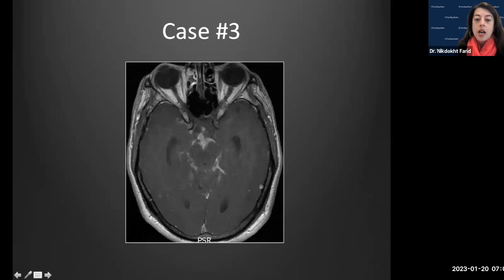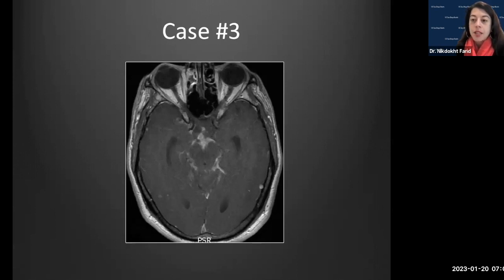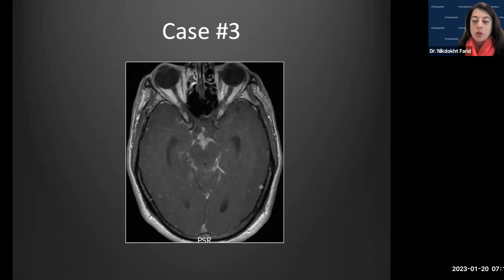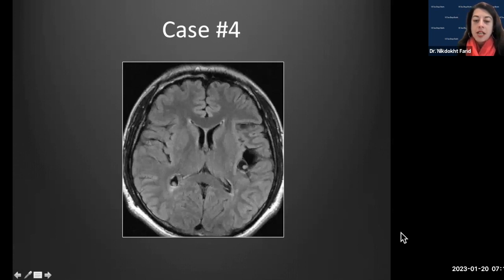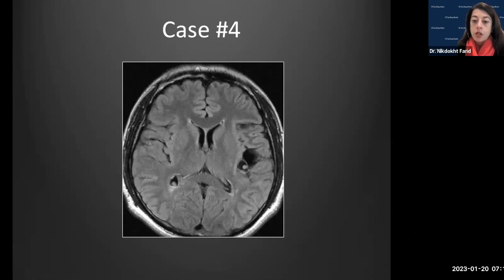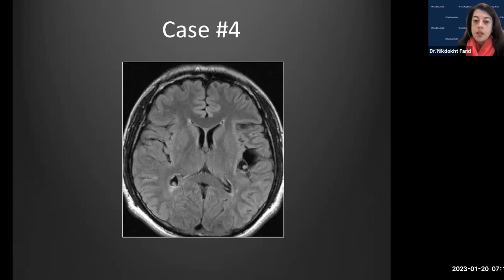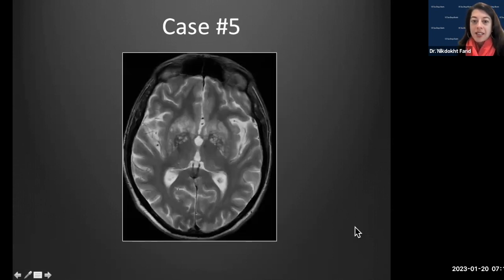Case three shows a single axial T1 post-contrast image at the level of the midbrain. The history for all these cases you can guess: fever, headache, maybe altered mental status. Case four is a single axial FLAIR image — direct your eyes to the region of the left Sylvian fissure and also to the atrium of the right lateral ventricle. Case five is a single axial T2 image at the level of the basal ganglia.